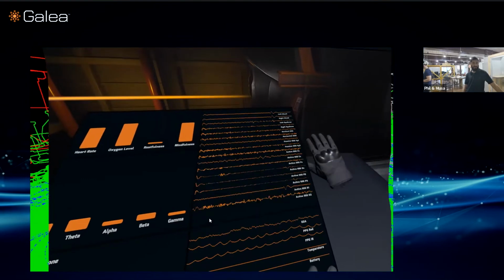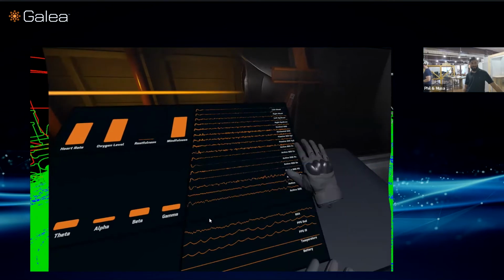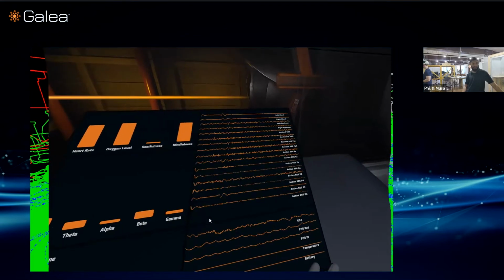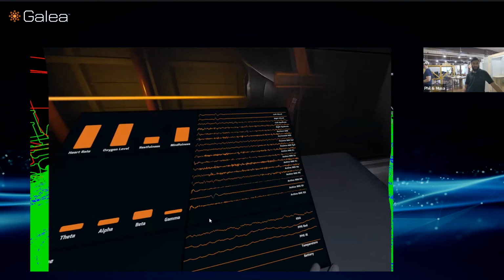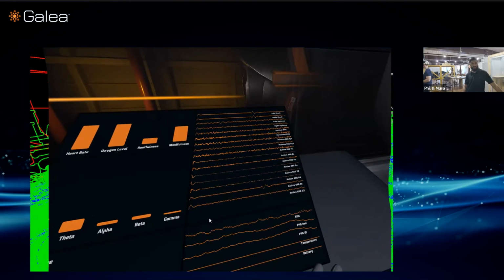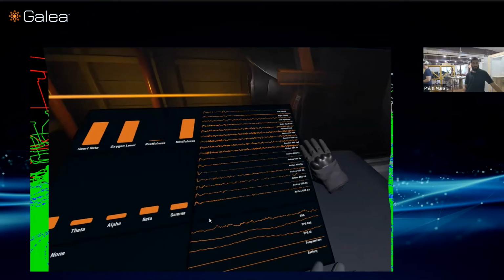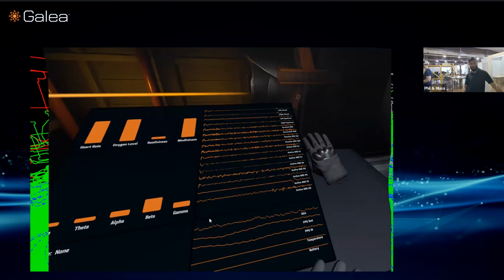So below EOG, we have passive and active EEG. EEG stands for electroencephalogram. And those of you who are familiar with OpenBCI know that OpenBCI has a lot of experience with electroencephalography. So we have a lot of existing products that acquire EEG data. The top two are passive EEGs, and they're at the FP1 and FP2 locations. That's on the frontal lobe.